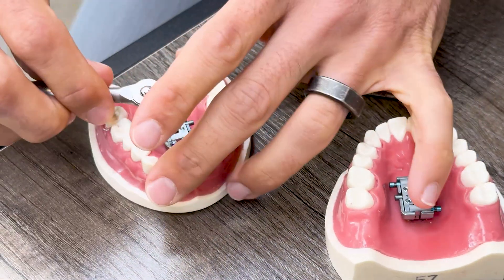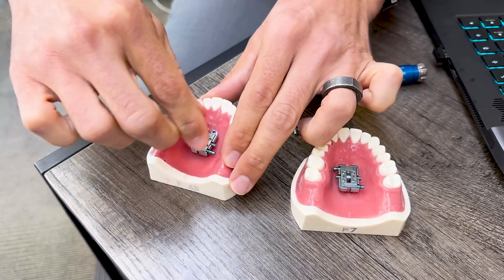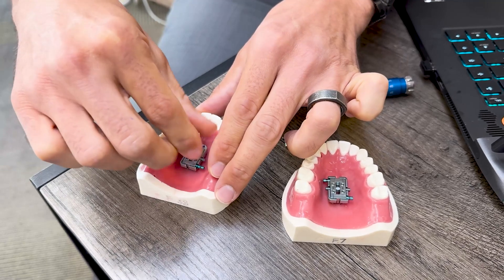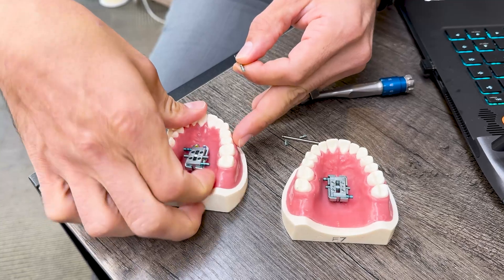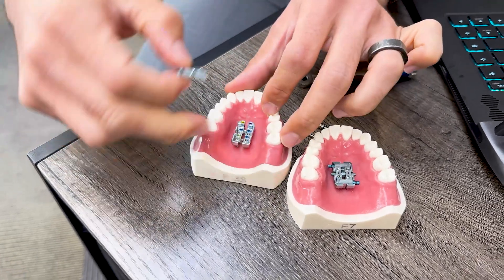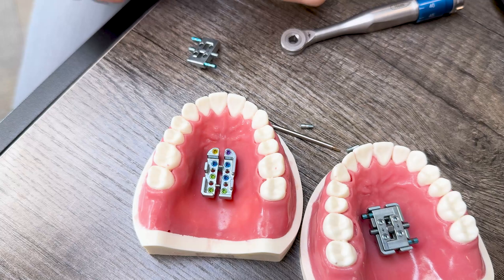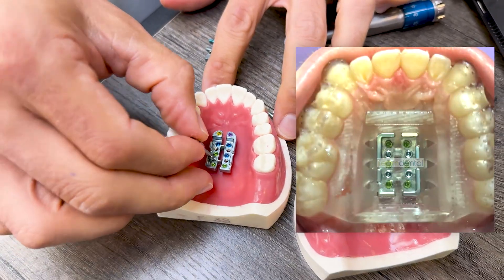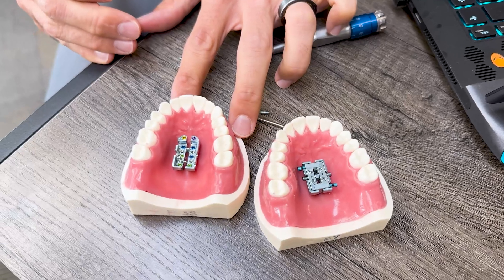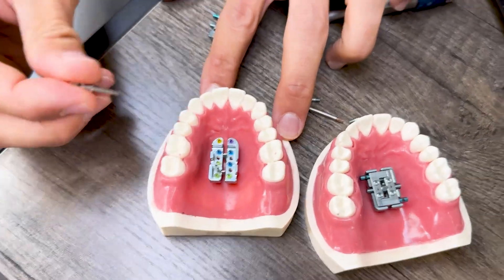We'll actually undo these so you can see — you can't do this on a patient but it's a lot easier on a typodont. When you're placing the initial anchor bodies, these same exact screws that I'm unscrewing now are fixated into the anchor body and holding it in the exact position it needs to be held. The interchangeable screw portion can be removed — if more expansion is needed you can get a different one. When placing the anchor bodies and putting the TADs in, there is a guide that goes over top, and that guide is screwed into these holes with these same exact screws. The guide is screwed onto the palate before the pilot holes are drilled — just like in orthognathic surgery where they sometimes screw the guide into the bone before placing the plate.